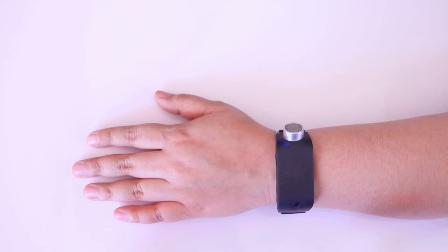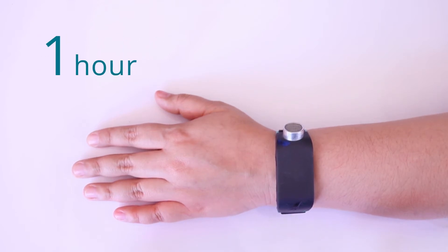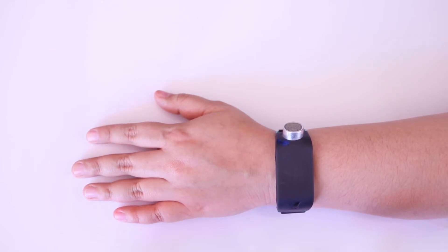Sonoban uses a series of long and short pulses to tell the time. A long pulse equals 5 and a short pulse equals 1. You will need to add up the number of short and long pulses that you feel to calculate the time.